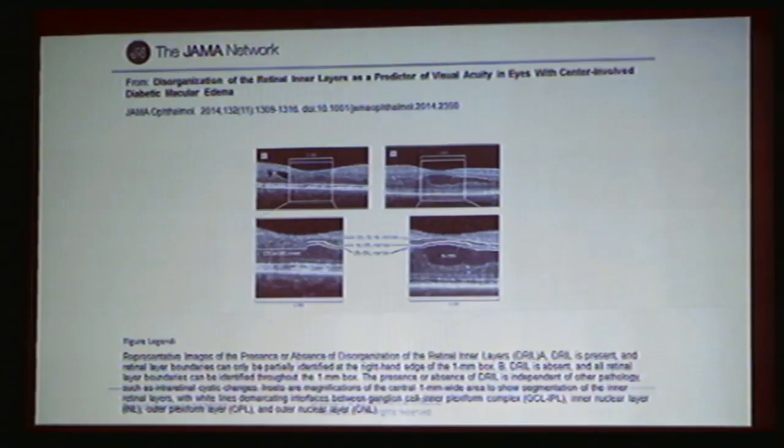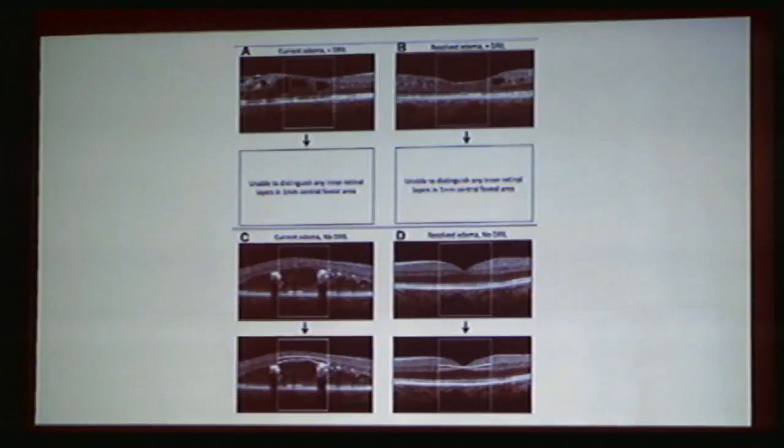So when you treat this patient, even though he's got larger cysts under the fovea, his vision will pick up faster, although at the beginning, the thickness is actually worse than this patient. Let me show you another example. Patient with massive cysts, photoreceptors are good. You do the treatment, whichever you like to get rid of the fluid.